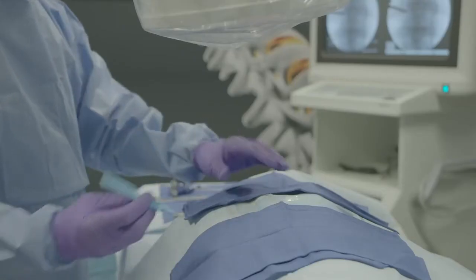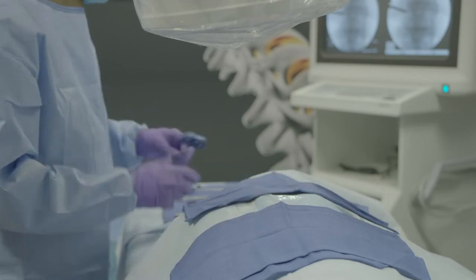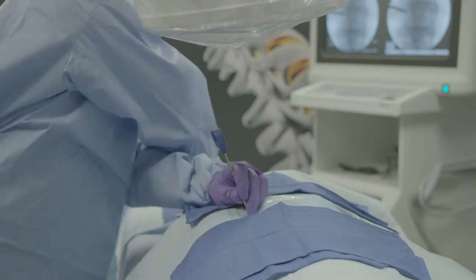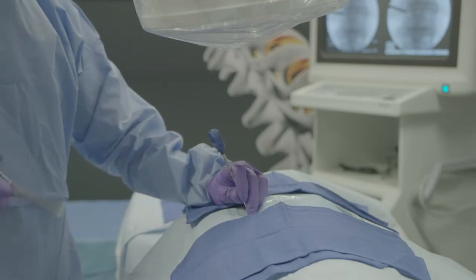Initial incision is made 2 to 3 centimeters lateral to the pedicle border. In the AP view, verify that the access introducer is docked on the lateral border of the pedicle at about the 9 o'clock position.